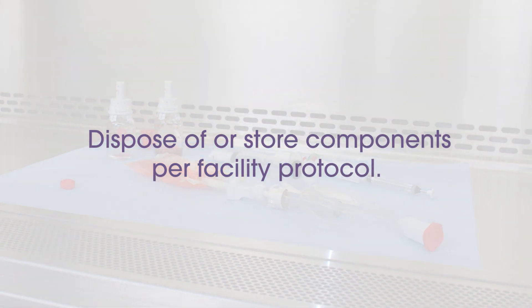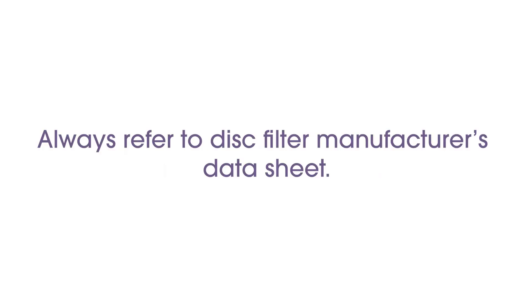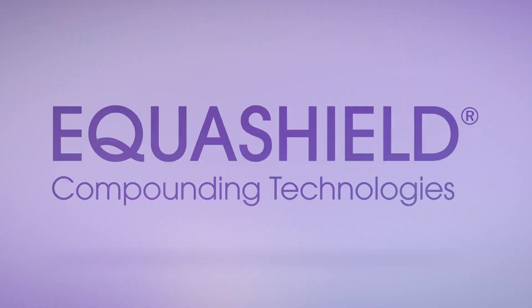Dispose of or store components per Facility Protocol. Always refer to Disk Filter Manufacturer's Data Sheet.